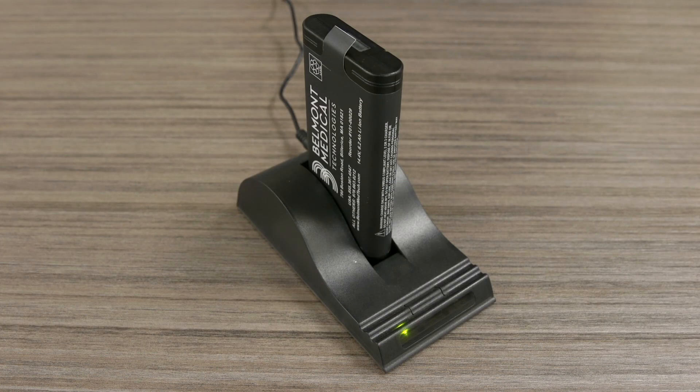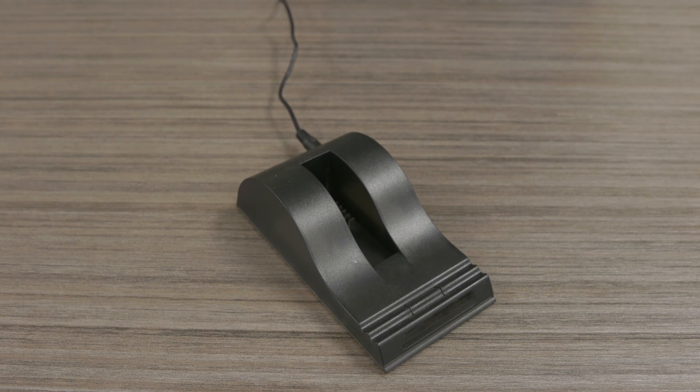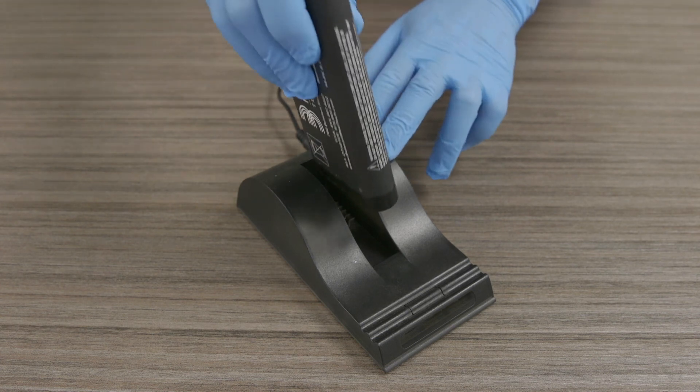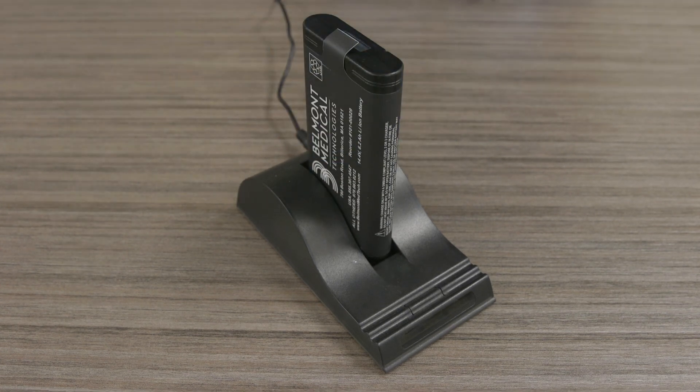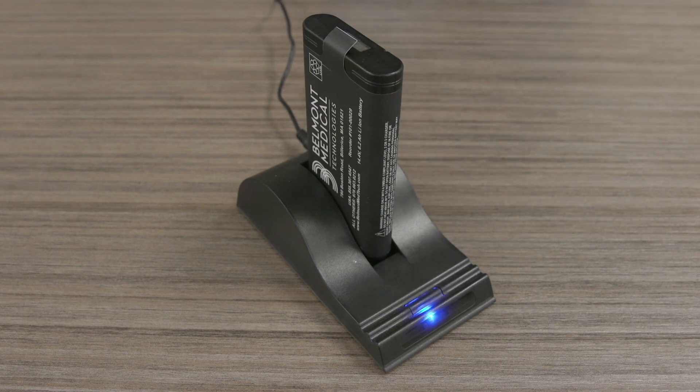When the battery fuel gauge needs to be recalibrated, the red LED indicator on the battery charger will flash. The recalibration is used to ensure the reliability of the battery capacity. To recalibrate the battery, first place the battery into the charger bay ensuring that the 5-pin connector is fully seated, and then press the center calibration button on the charger. The blue LED will flash to indicate that the battery is undergoing the recalibration cycle. When the blue LED is solid, the battery is fully charged and fully calibrated.